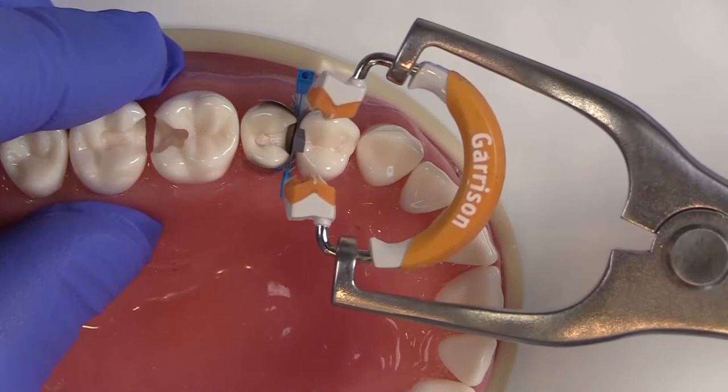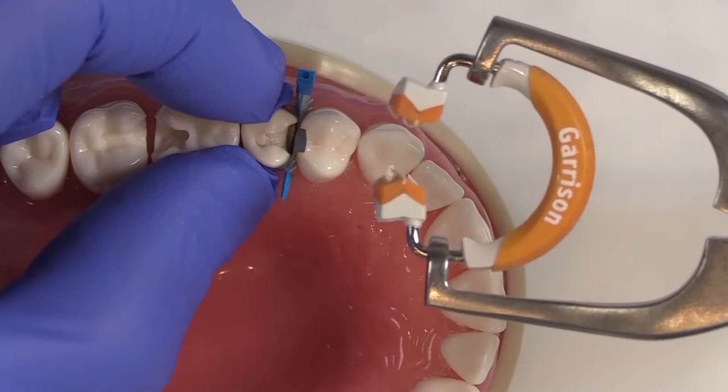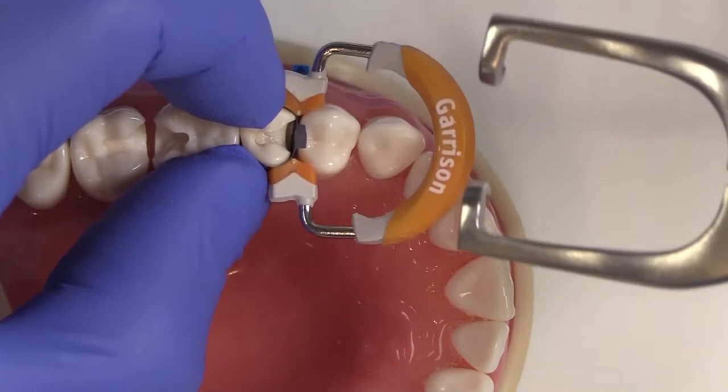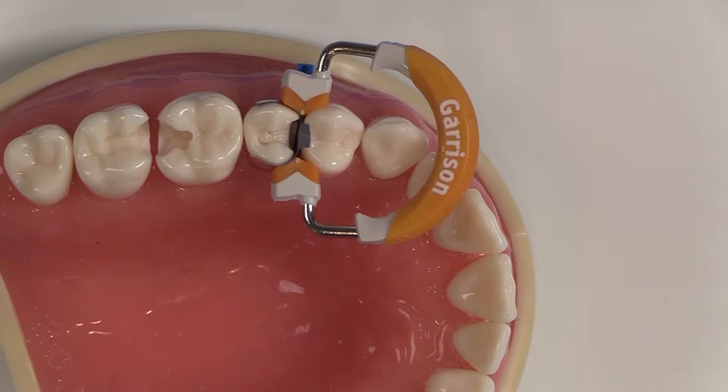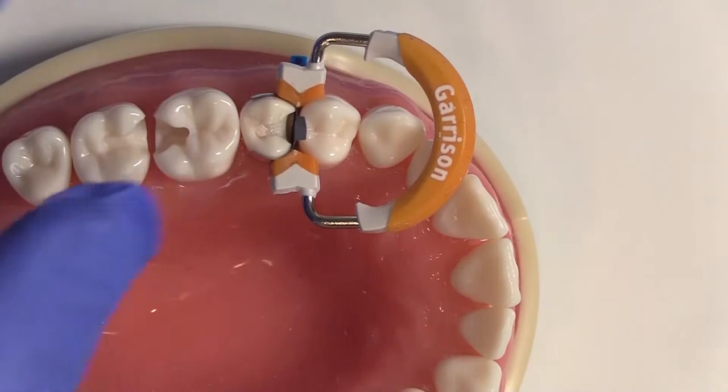If you come from the distal direction, you'll tend to bunch the matrix band up and create creases or folds. What I do is hold this here, come in from the mesial, and push towards the tooth or the surface I'm trying to close, then release. I verify everything, and if I need to reposition, I'll loosen a little bit, tighten the matrix band with my fingers or an instrument, and let go again to get better adaptation.